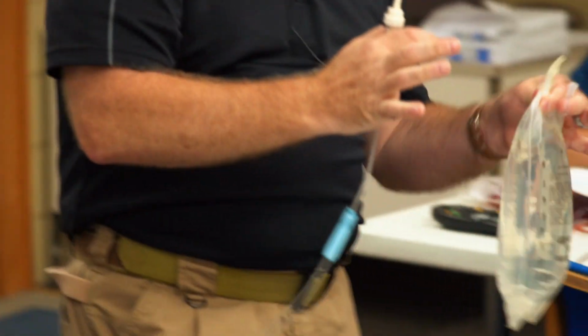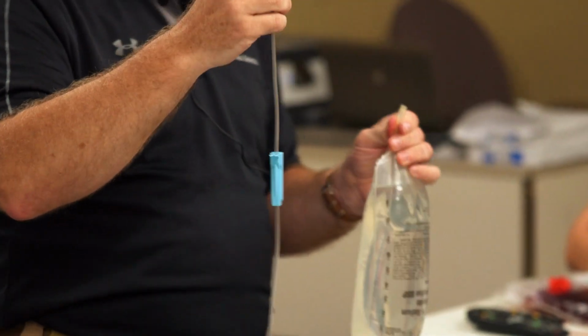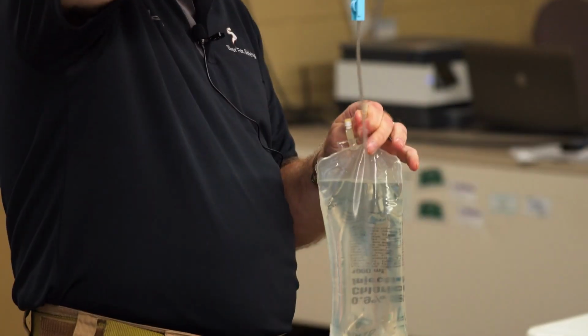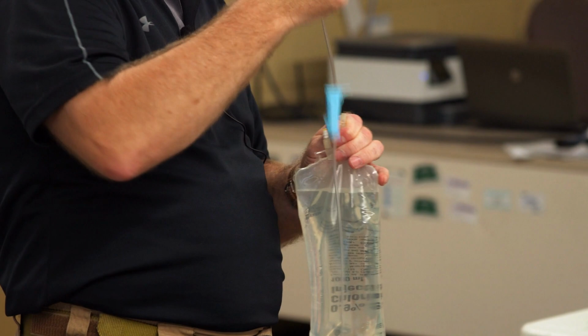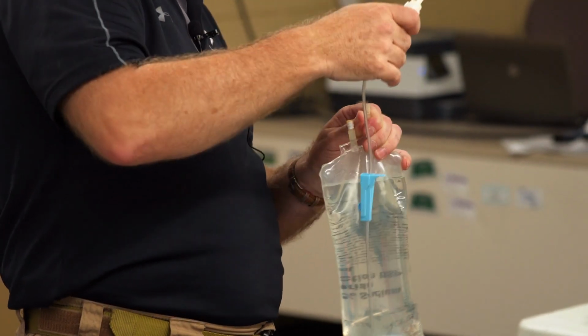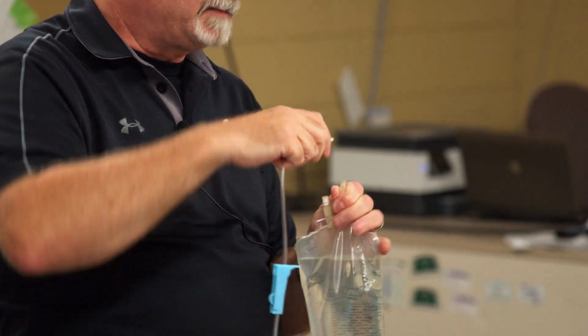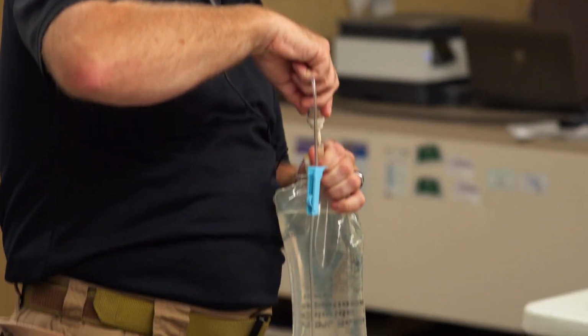I'm not touching in there. I get rid of that. So now this, and here's the trick. A friend learned this once. Make sure we're going straight in instead of sideways through. I have actually punctured my thumb with this before. So you take this nice blunt, whitey thing. That is sharp. Oh, son of a. Okay.